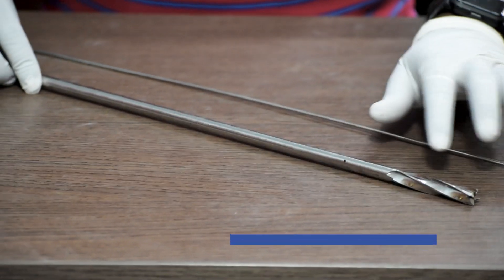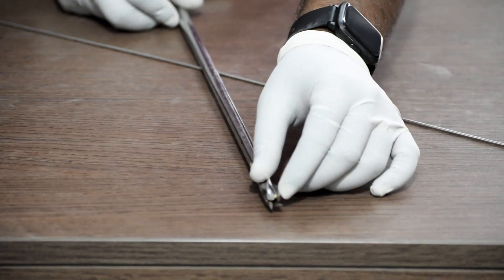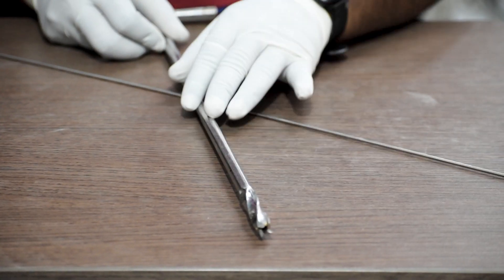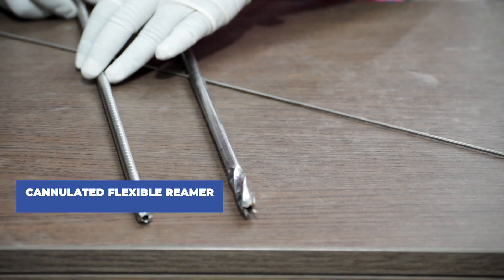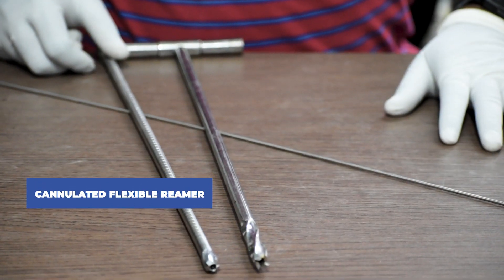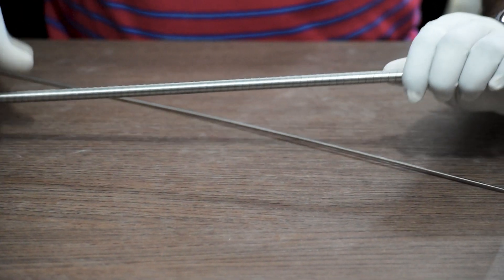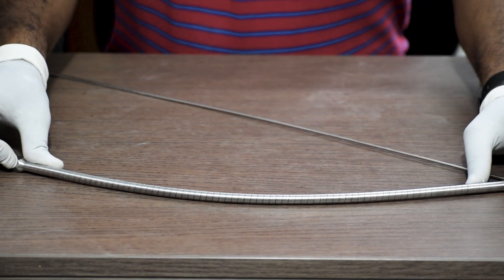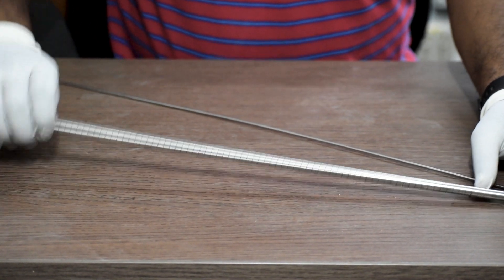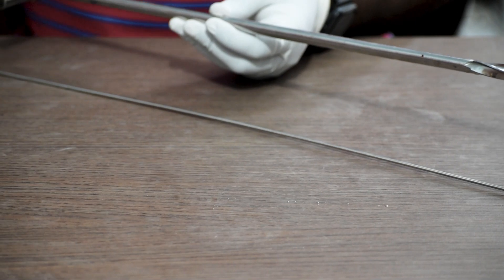Next, we will use a cannulated solid hand reamer to ream through. As you can see, this is cannulated and it is a solid hand reamer. Alternatively, we can use a cannulated flexible reamer — as you can see, this one is flexible. We use a power drill to operate this reamer. It is upon the surgeon which reamer he prefers to use.